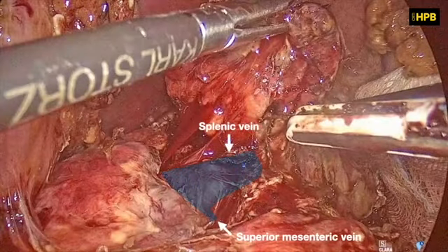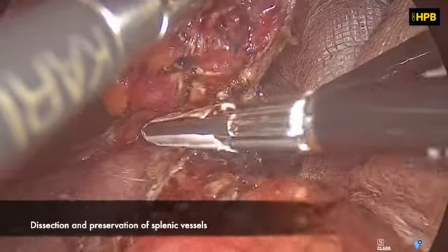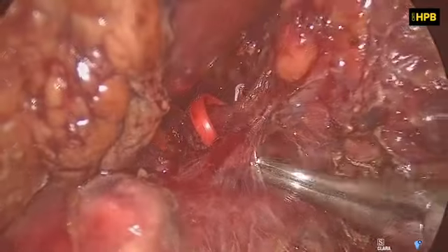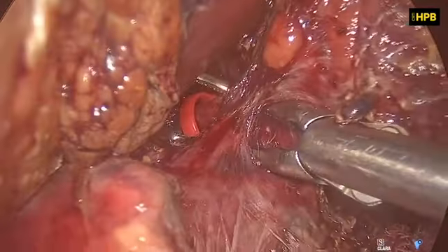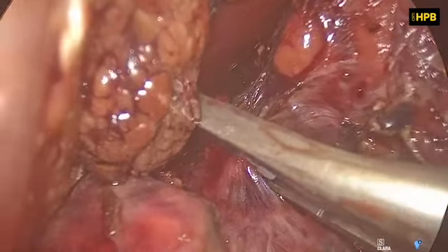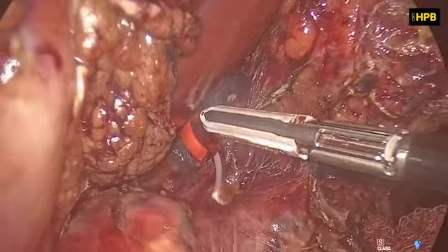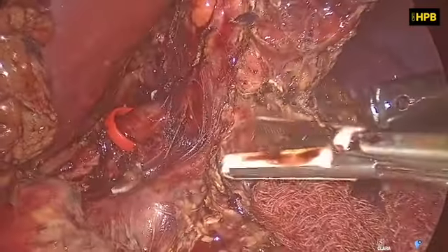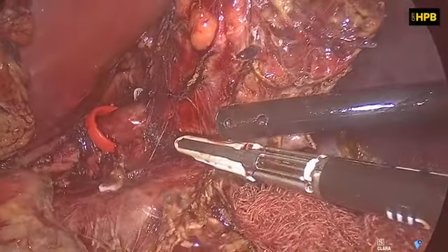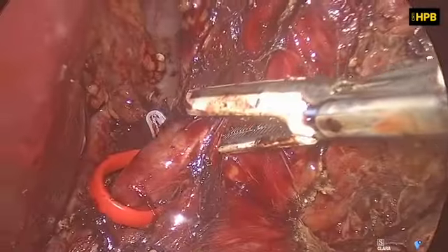The splenic artery and vein were dissected and preserved. The small caliber branches from the splenic vein were sectioned with bipolar coagulation, and the larger caliber ones with hemologs. This surgical procedure is technically feasible and safe in experienced hands.